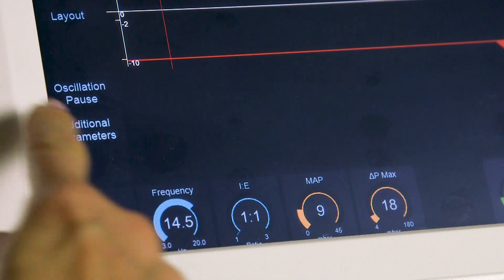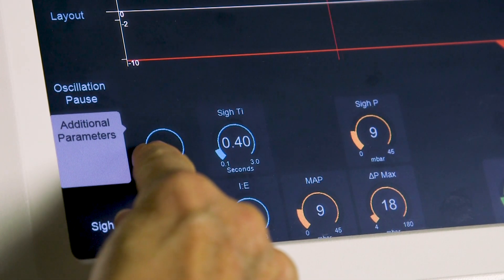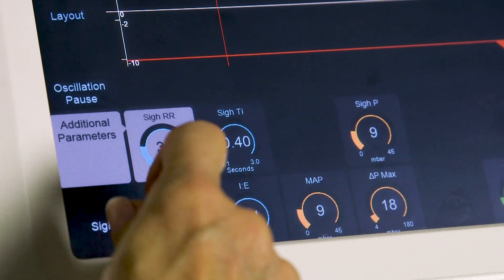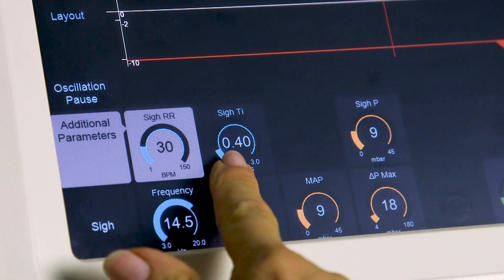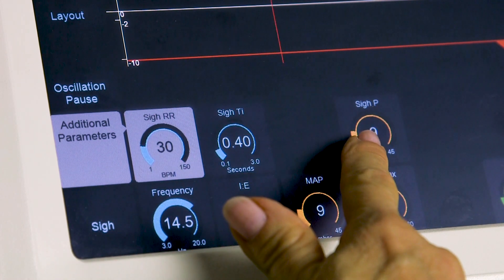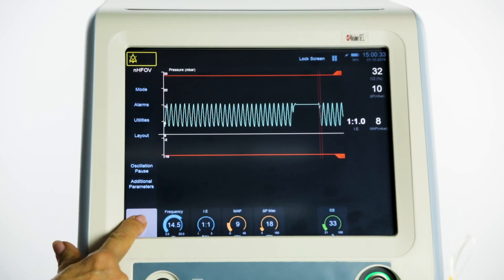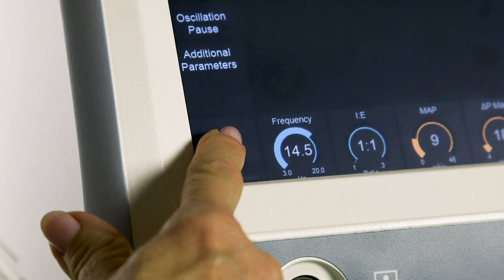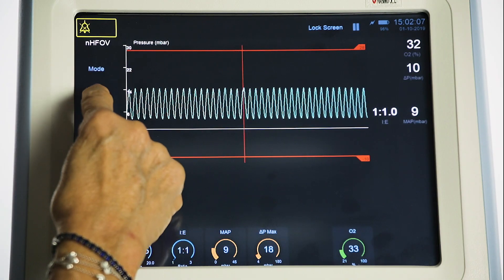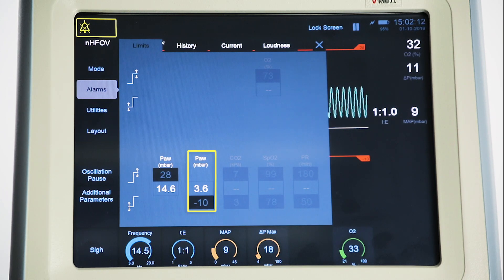Additional parameters which can be set include: SIRR, the respiratory rate for SIR breaths in place of oscillation; SIRTI, the inspiration time for SIR breaths; and SIRP, the PIP for SIR breaths. When in this mode the user can deliver manual SIR breaths using the SIR button. Alarms include high peak airway pressure and low peak airway pressure.